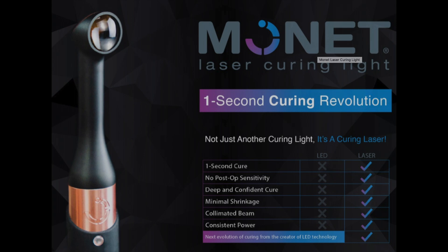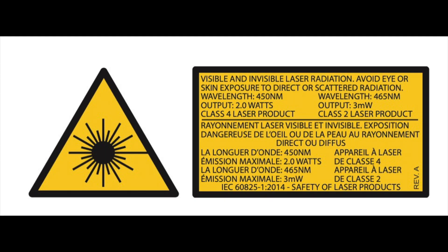The Monet is an extremely powerful laser curing light. In fact, it is a Class 4 laser.